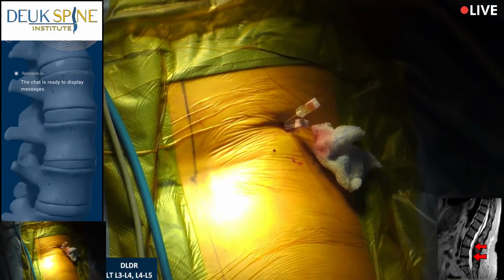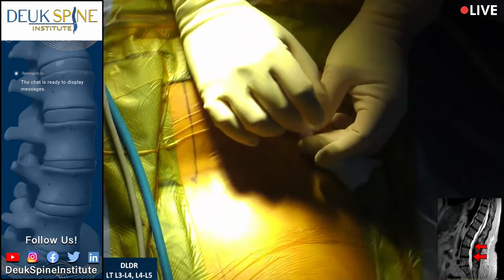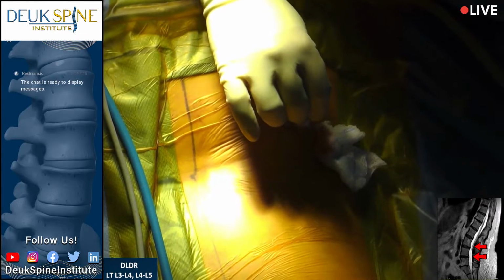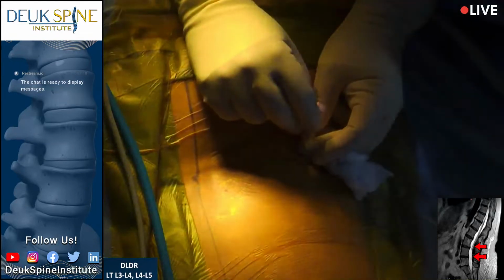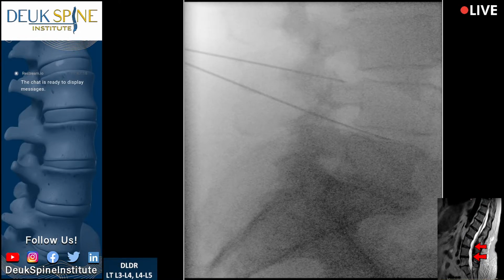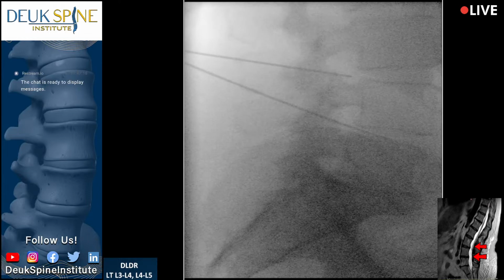All right, welcome back, folks. We are just about ready to get started. I just talked to her and I asked her, are you having pain? She said she's okay. Nobody likes laying on an operating table, let's face it. But we're getting this done. Yeah. Good. I feel the herniation.